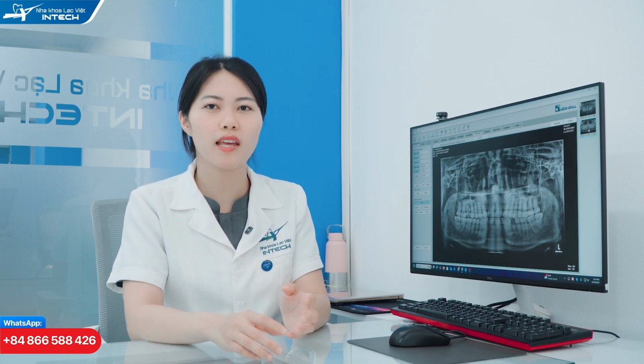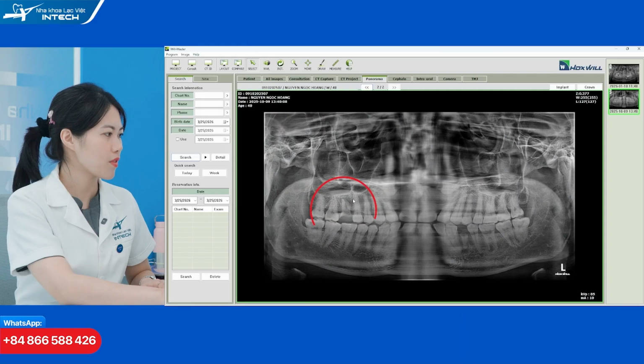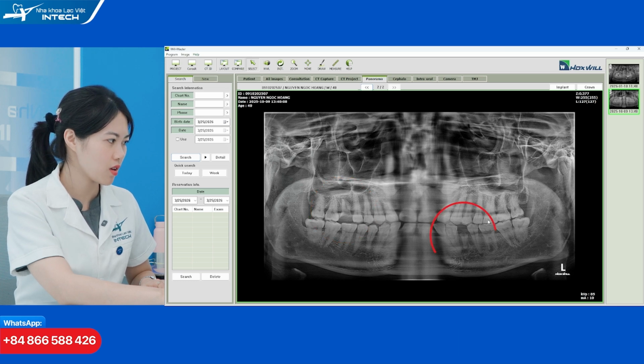planning in implant dentistry. A 40-year-old male patient presented with multiple compromised teeth in both maxillary and mandibular posterior regions. The patient's chief complaint is discomfort during chewing and recurrent swelling in the lower left region. So we collect all the necessary data, including mandatory X-ray. The panoramic shows that there are residual roots in upper right 6 and lower left 4. The patient also has a periodontitis lesion associated with lower left 5 and 6.